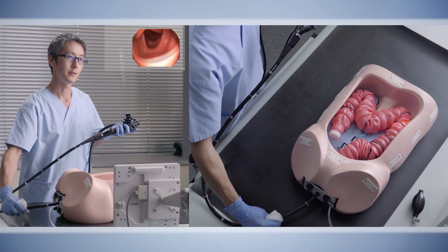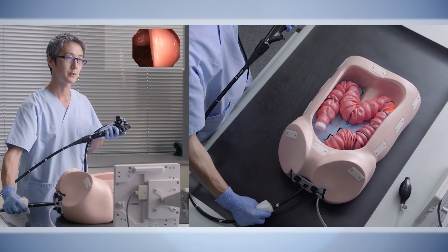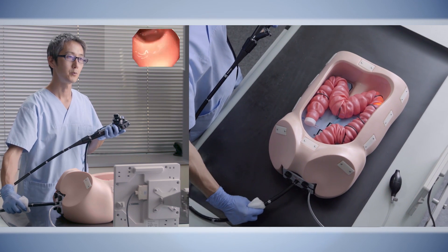So first, in Exercise 4, before you proceed, you always confirm that you have a one-to-one reaction.